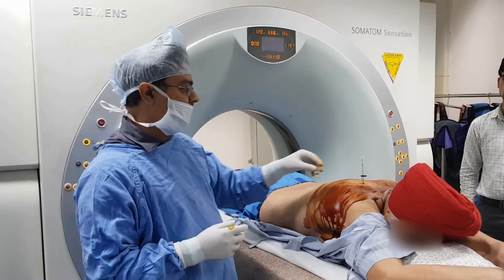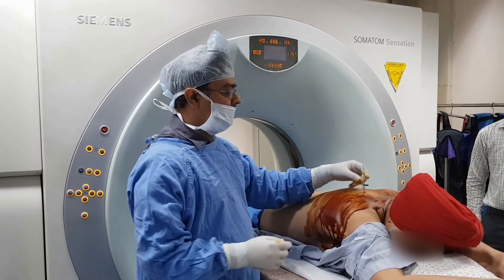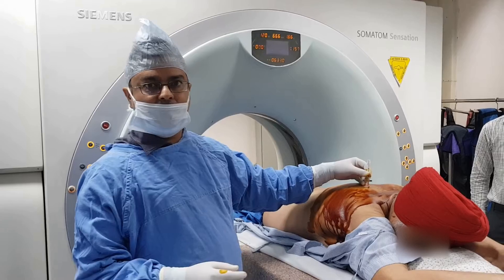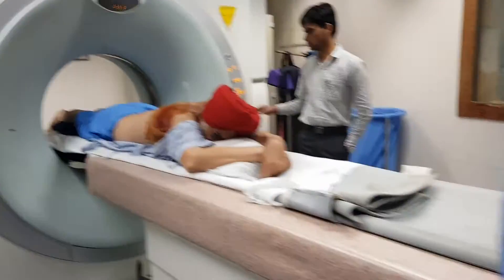Good morning. We have a consolidation at the right posterior lung base. We have a marker needle and a monopty cannula through which we will take biopsies. We will show you on CT scan.